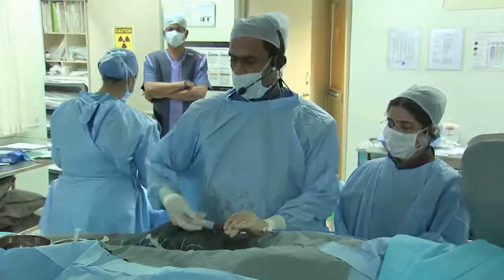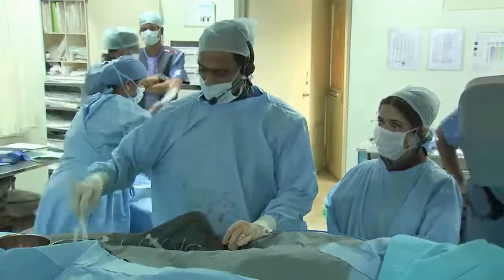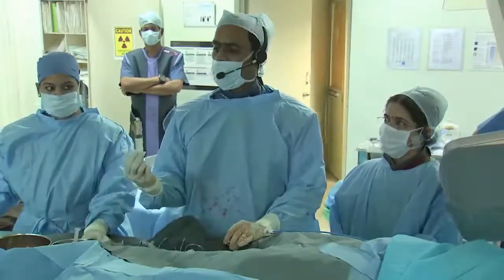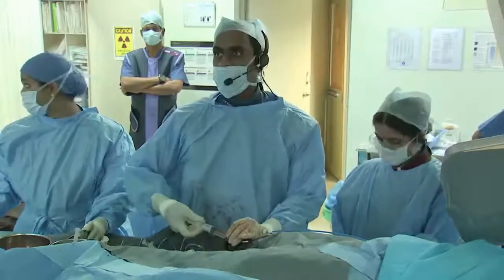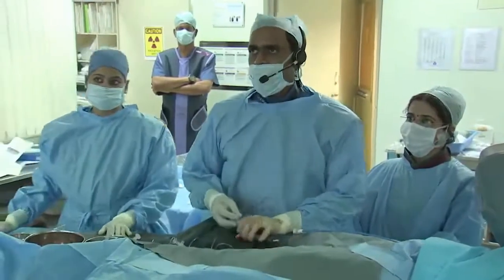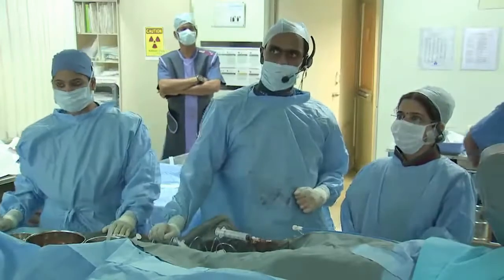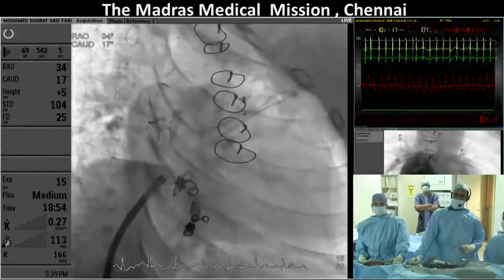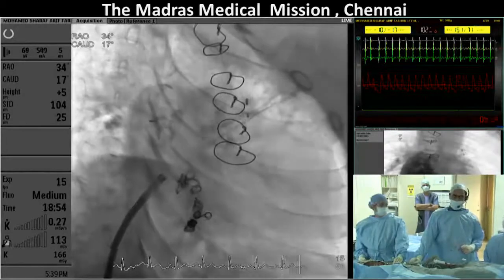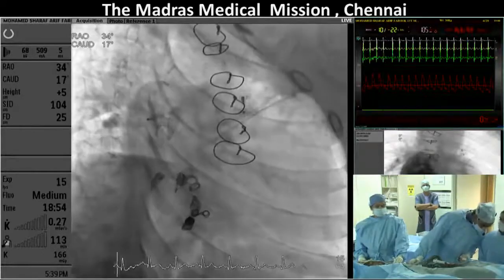Okay, well, excuse me, just before going to Frankfurt, for those who do not have that kind of device, is it possible to use a homemade fenestration? I mean, just opening the device with any dilator or things like that for those who do not have such kind of device? Well, I did that quite a lot with the old Starflexes and CardioSeals. We probably put in 30 or 40 of those devices.